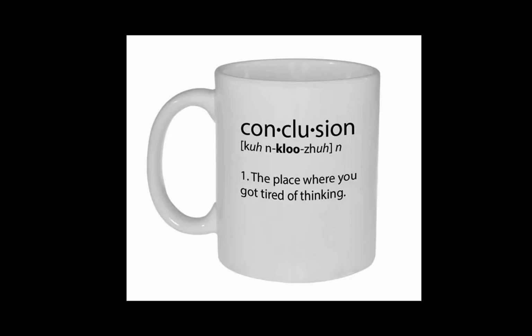Let's bring it home. In summary, RUSH stands for Rapid Ultrasonography for Shock. The HIMAP acronym can help you remember the sequence, or you can think of it as the pump, the tank, or the pipes. Clinical integration is key. Remember to put all of your data points together along with the history and the physical, before prematurely anchoring on a specific diagnosis. The exam was designed to take 2 minutes or less, and there is a decent body of evidence that supports you taking on this skill set.